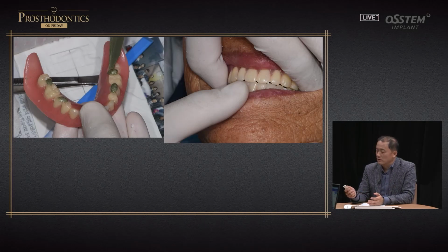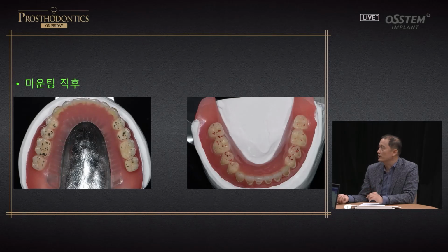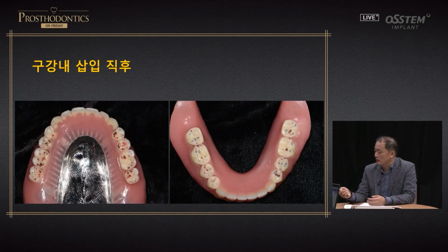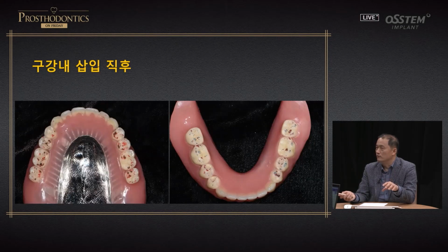As you can see here, these steps are needed. Before occlusal adjustment, through this you guide the central relation, and after mounting, you check whether it's all okay. Even with detailed adjustment, you can have this type of contact, but it takes too much time to make it orally. So without intervention of the soft tissue, not orally but on the articulator, you should do this. Immediately after delivery into the mouth, and immediately after occlusal assessment, you see there is a difference. As you know, what seems to be unfit on the articulator doesn't happen exactly like that in the mouth, because soft tissue moves.